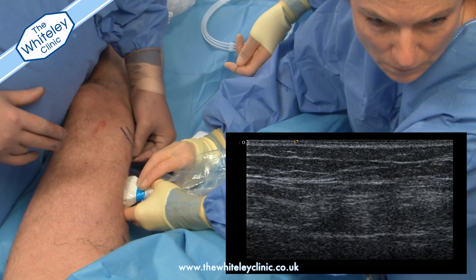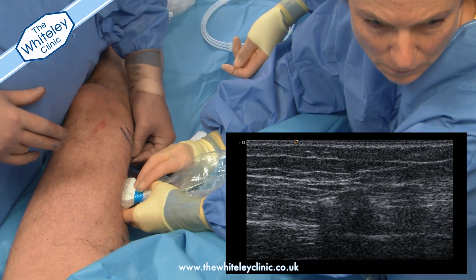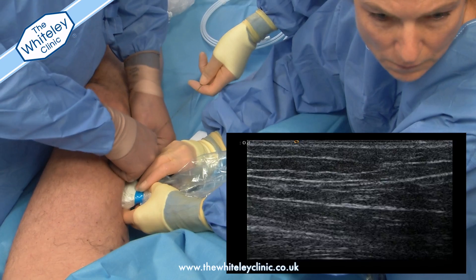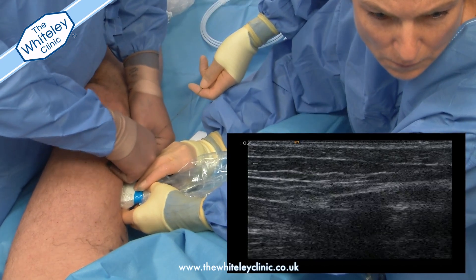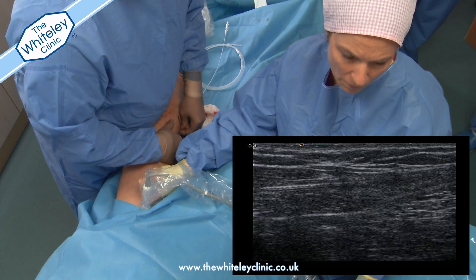The procedure starts by inserting a needle into the vein. This is under ultrasound control, and at this point in the video you can see the needle inserted into the vein on the ultrasound inset down on the right. This is the only part of the procedure that needs a local anaesthetic.